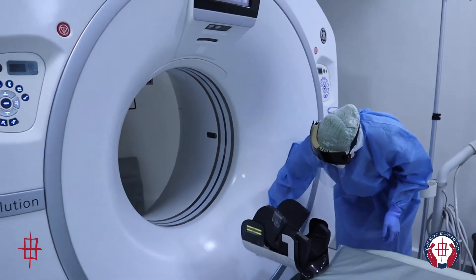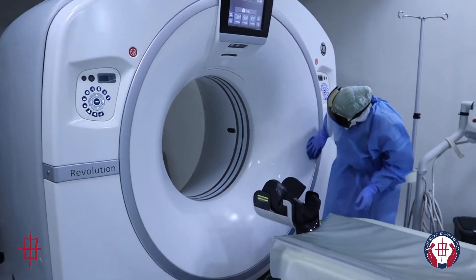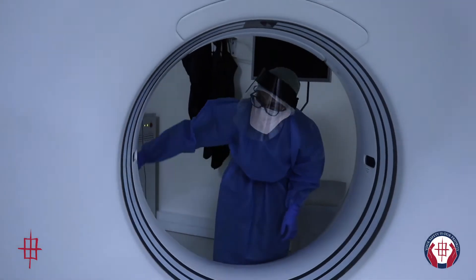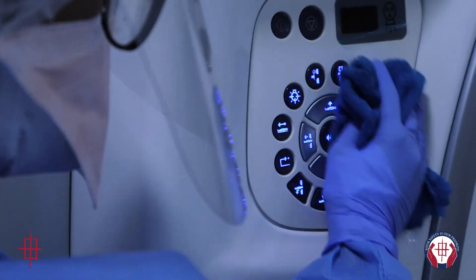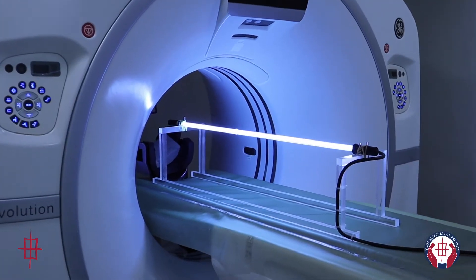After each procedure is performed, all equipment is first cleaned with a chlorine-based disinfectant, followed by 70% alcohol wipes. The UVC light is then activated in the room to further disinfect all the surfaces.